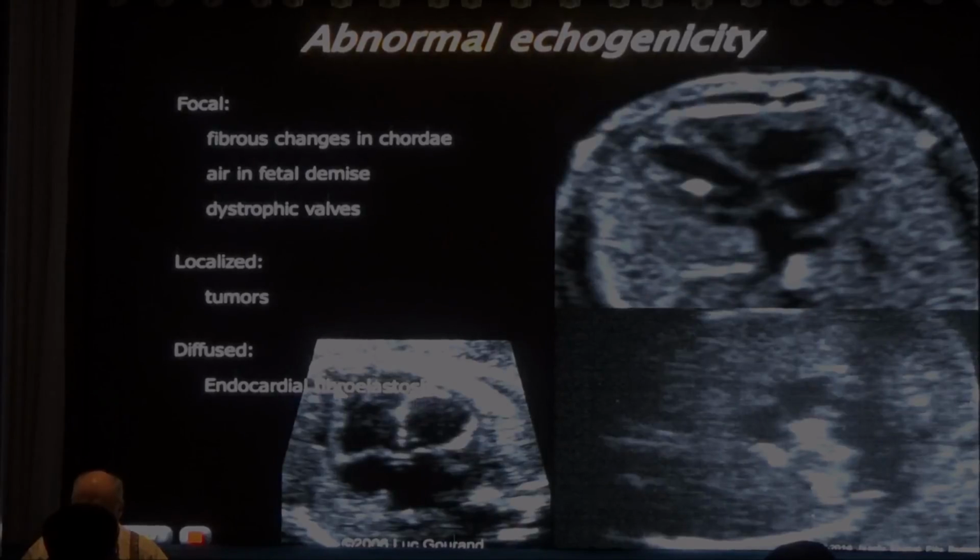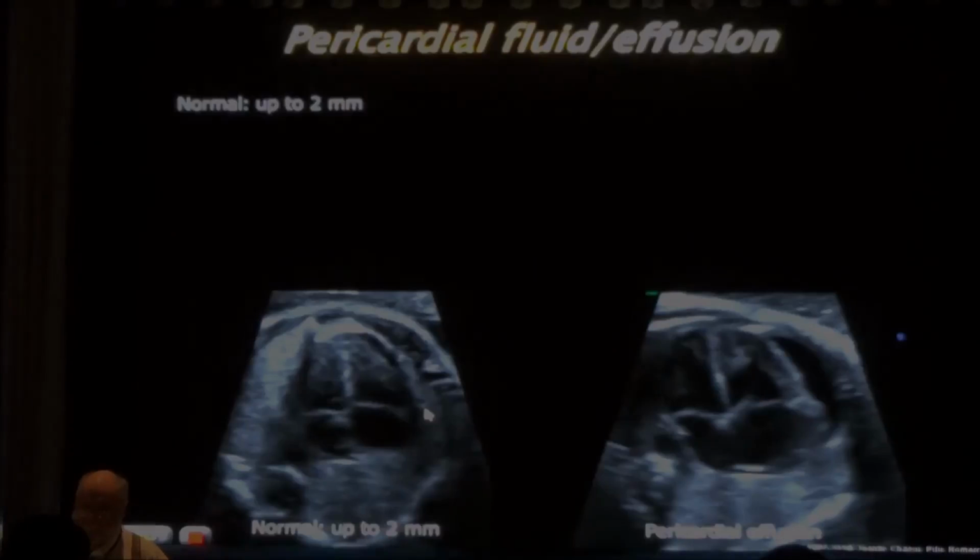This white line here is called endocardial fibroelastosis. And here you see the left ventricle is very large, but it doesn't have the normal shape. It's not elongated like the normal left ventricle. It's very round. And if you look in real time, that left ventricle is not contracting at all. It's fixed. It's a sphere that is not moving. And if you do color Doppler, you will see no color Doppler going to that. So this also is a hypoplastic left heart syndrome, but now with a distended left ventricle. So differentiate between hypoplastic left heart syndrome and the size of the left ventricle can be anything.